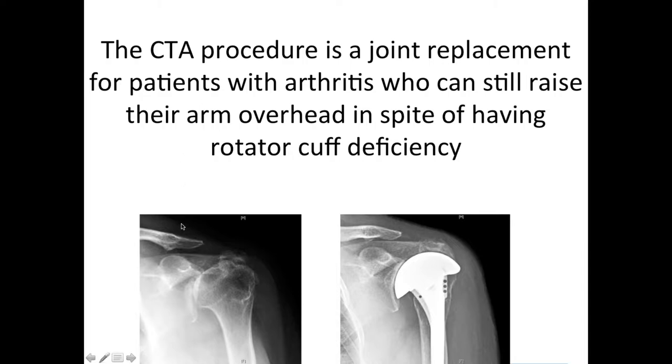Here at lower left you can see we've got a very arthritic joint. We can also see that the humeral head is displaced upward, so it's rubbing against the acromion, which is the bone at the top of the shoulder. But this patient was still able to raise her arm up over her head.